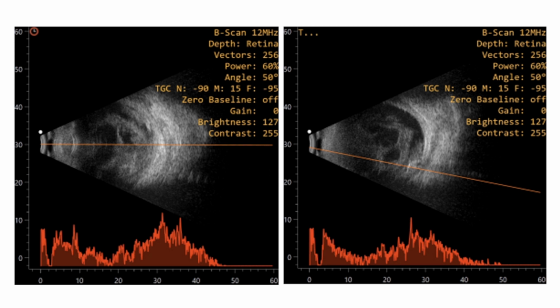What else? You want to induce a PVD, so you want to know if PVD is there or not, right? These are all things you should look for while doing the ultrasound.